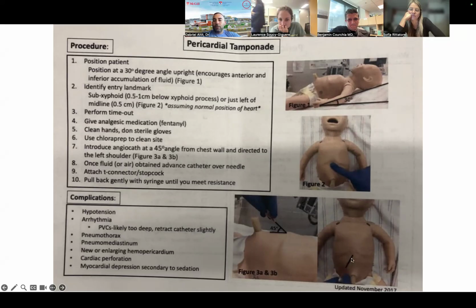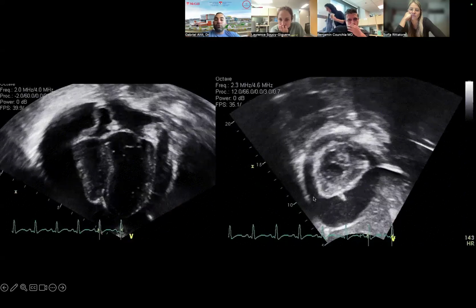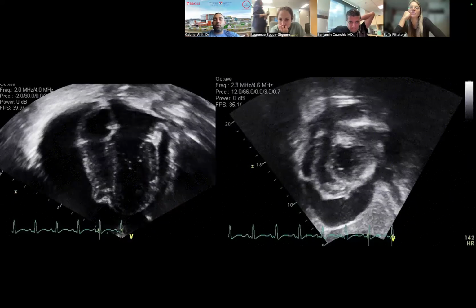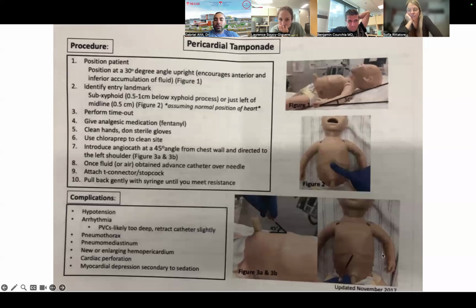See where you're putting your needle. Of course, you've already outlined that this patient doesn't have a dextrocardia, so you know where the heart is within the chest in terms of position. At this point, because you're in tamponade, personally, I wouldn't necessarily use echo guidance to look at my needle, but if someone is there to help you, you can always have the echo probe to see where your needle is going. But in these patients, the sac is so overfilled because you're in tamponade that typically you're going to start entering your needle.